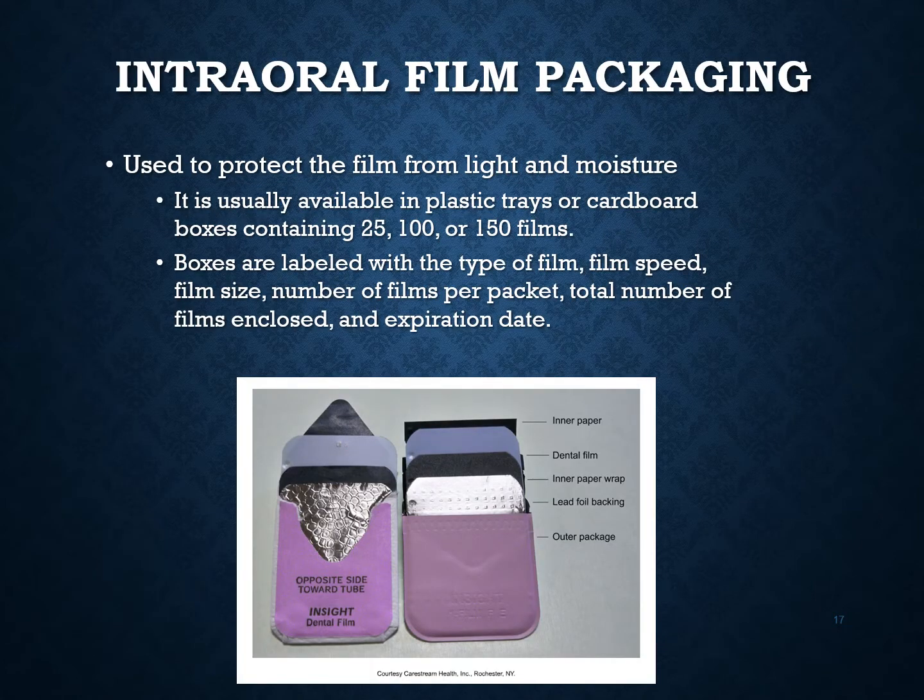Okay, so the film packaging is used to protect the film from light and moisture. It's usually available in plastic trays or it comes in cardboard boxes, and it contains 25, 100, or 150 films. The boxes are labeled with the type of film, the film speed, the film size, the number of films per packet, because some film packets have one or some of them have two, and by one and two, I mean one dental film or two dental films. And then the total number of films enclosed, which is the same thing. And then the expiration date is on there too, because these things do expire.